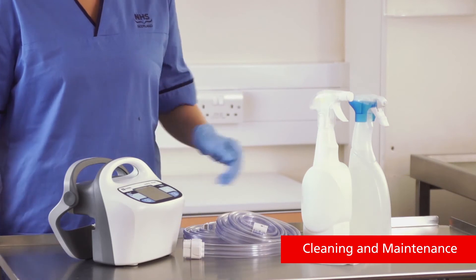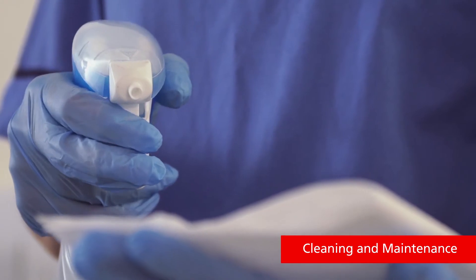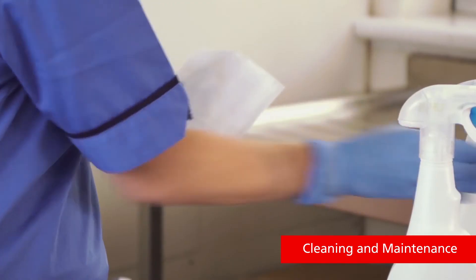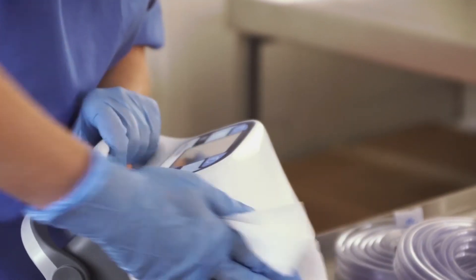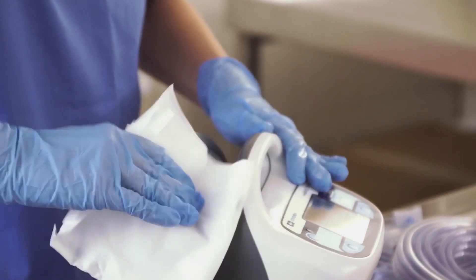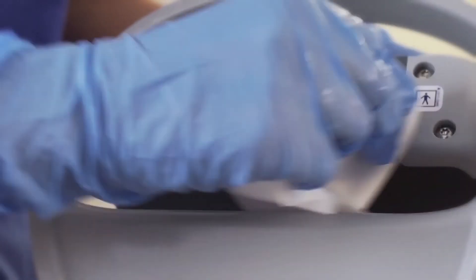The Kendall SCD 700 Series controller can be cleaned with a soft cloth dampened with water or mild detergent. To sanitize the device, apply cleaning agents with a cloth or wipe. Avoid excessive spraying, especially in the areas of the connection ports on the back of the device.